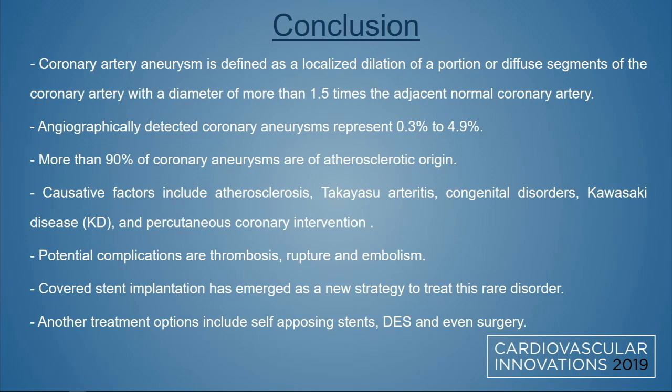Causative factors include atherosclerosis, Takayasu arteritis, congenital disorders, Kawasaki disease, and percutaneous coronary intervention. Potential complications are thrombosis, rupture, and embolism. Covered stent implantation has emerged as a new strategy to treat this rare disorder. Other treatment options include self-apposing stents, DES, and even surgery.